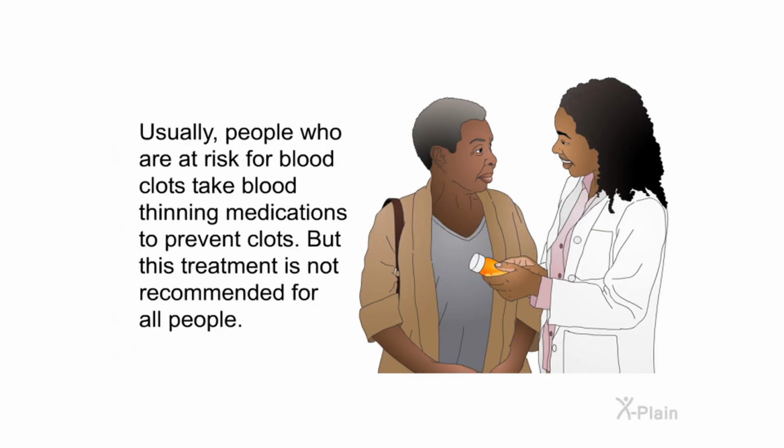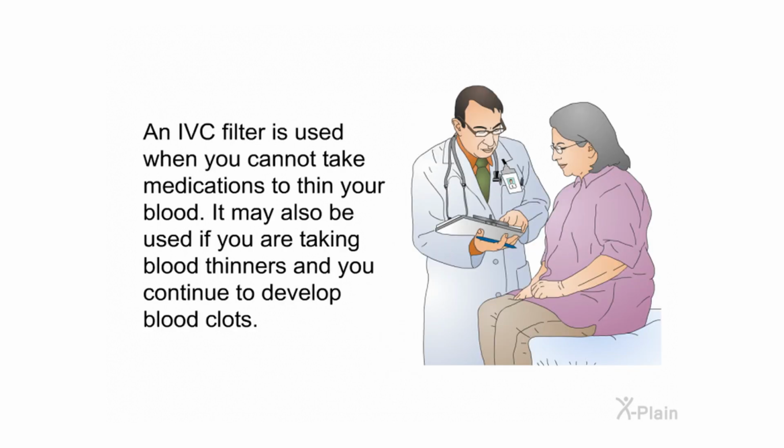Usually, people who are at risk for blood clots take blood thinning medications to prevent clots, but this treatment is not recommended for all people. An IVC filter is used when you cannot take medications to thin your blood. It may also be used if you are taking blood thinners and you continue to develop blood clots.